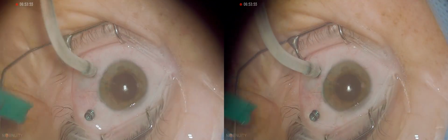The patient is phakic. A 23 gauge pars plana vitrectomy is set up and a wide fibrovascular band is noticed, crossing the macula from the topography of the superior temporal arcade reaching down below the inferior one.